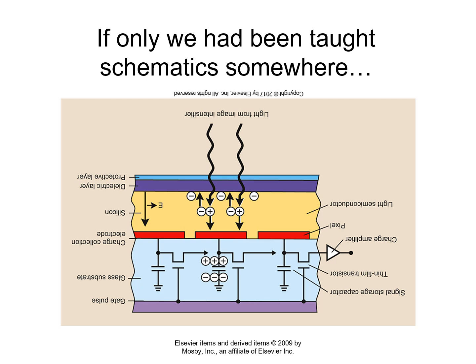Now, why would the positive charges start stacking there? Well, it's because the other side of the capacitor is connected to a ground. And so I need you to remember back to what I taught you about schematics. Capacitors are temporary storehouses of charge, like a temporary battery. And so grounds are infinite reservoirs of charge.